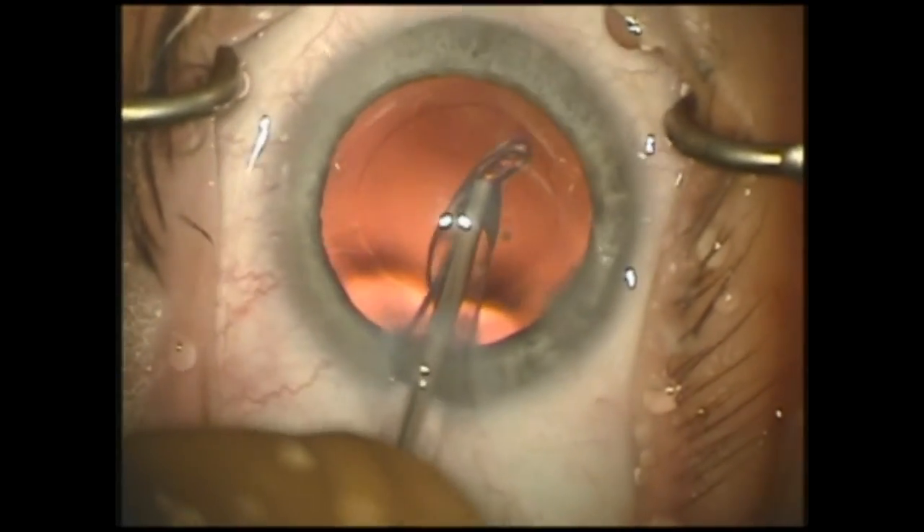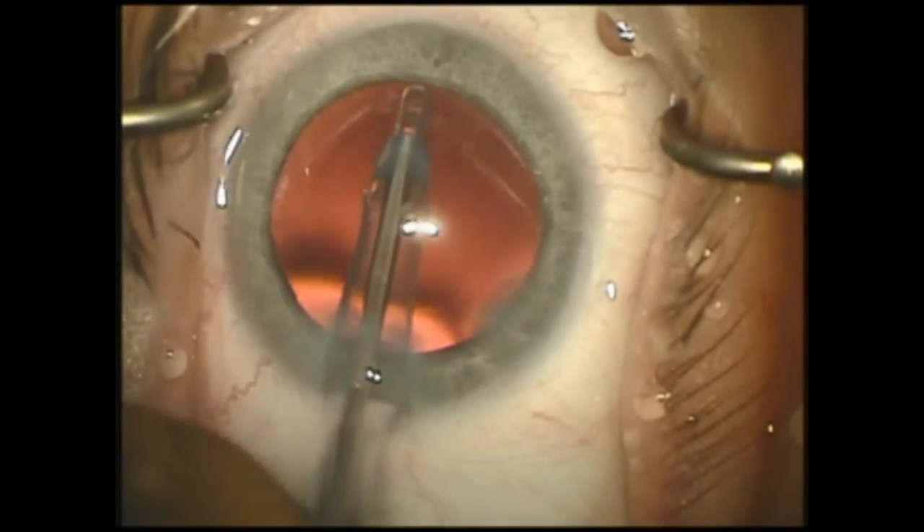After all the cortical material is removed and the capsular bag is polished, the eye is now ready for the implant.